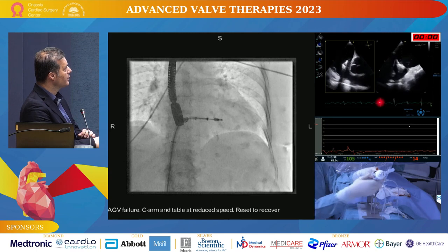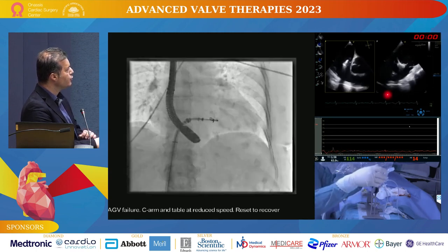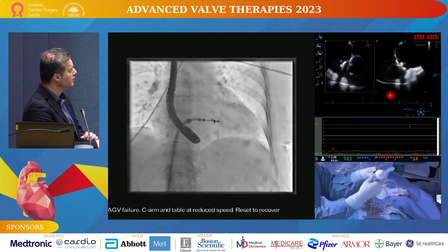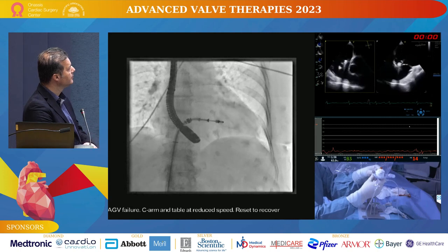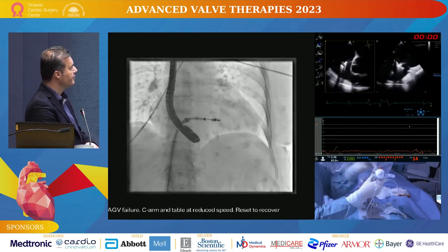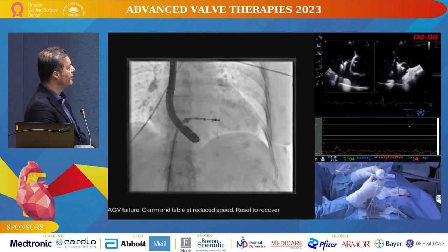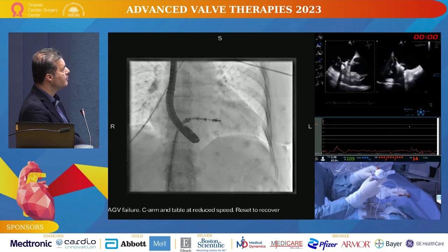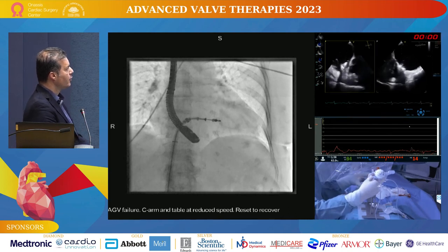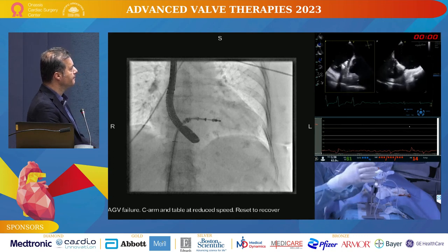Anterior leaflet is long, is in. Septal leaflet is definitely in. Now we're going to drop the grippers in a minute. We take our time. Sometimes we have to rotate, adjust the perpendicularity. It's fine movements. Echo has to follow. That's the most difficult part, millimeter by millimeter.